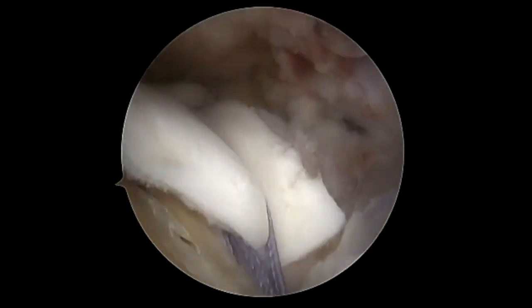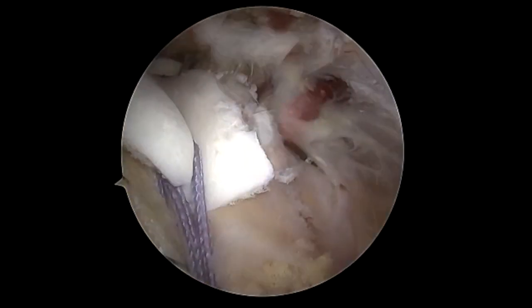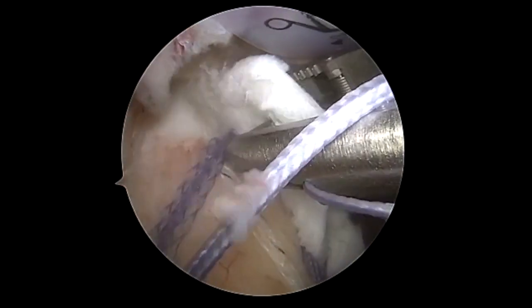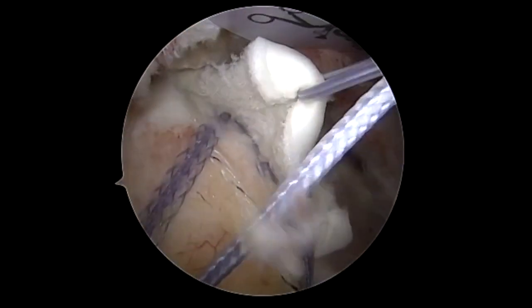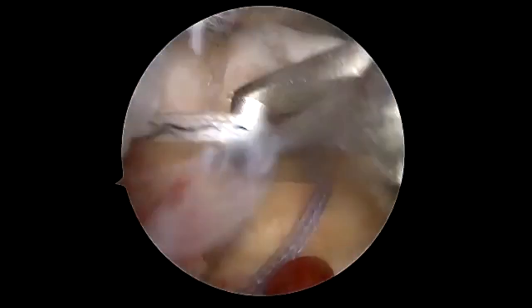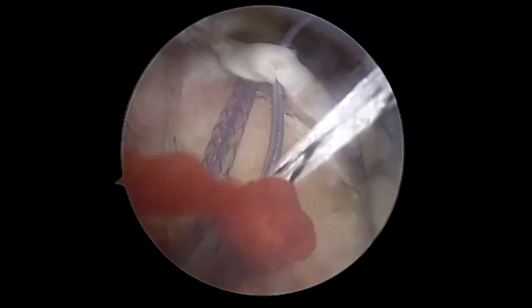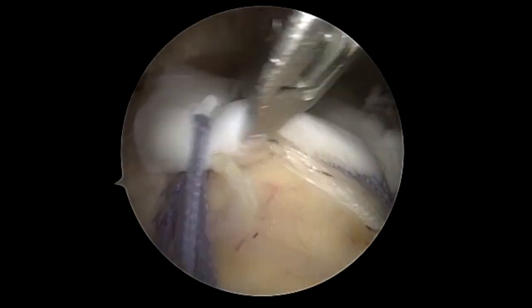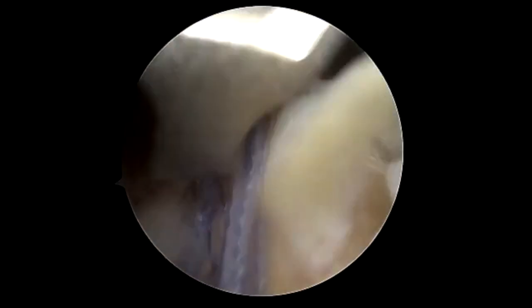We're going to retention this and cut it — you can also keep it and retention it later as well if needed. Now we're going to work posteriorly, just doing a simple interrupted suture. We pass the passing stitch, then take the two loading stitches, load this, and you can see us retentioning this knotless swivel lock — you're really going to get nice compression onto the entire lateral margin of the rotator cuff.